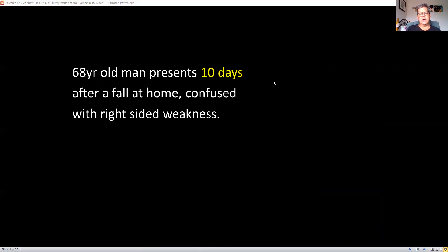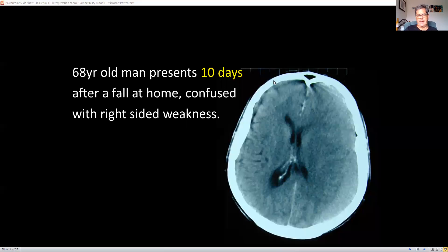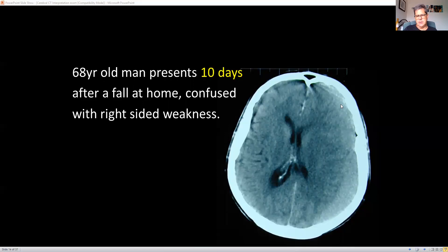A 68-year-old man presents 10 days after a fall at home, confused with right-sided weakness — so you'd be looking at the left side of the brain. It doesn't immediately jump out at you. You can see there's sulci with CSF on one side but none on the other, and a bit of effacement of the lateral ventricles on the left. When you take a double-take, you can see an enormous subdural hematoma that's almost completely isodense with the surrounding tissue. There's also a small isodense subdural above it.